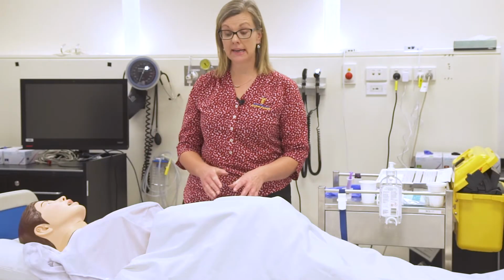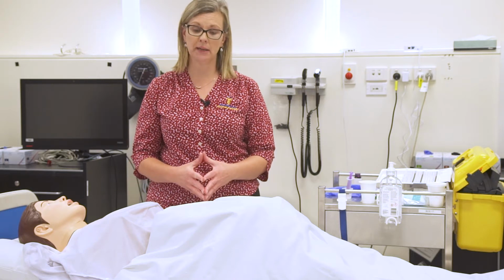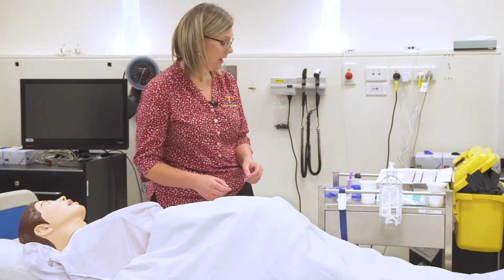So I'm Kristy. I'm here today to talk to you about the PEG tube medication management and cleansing of a tube.